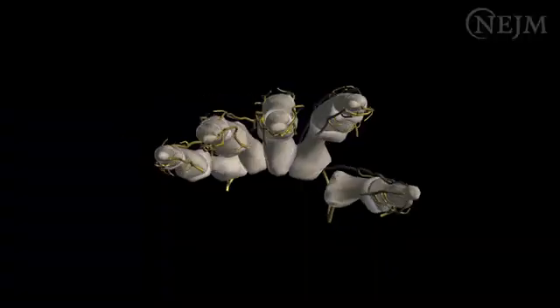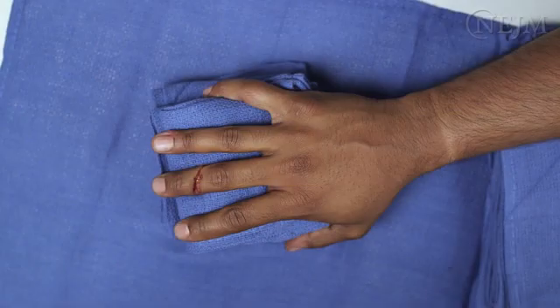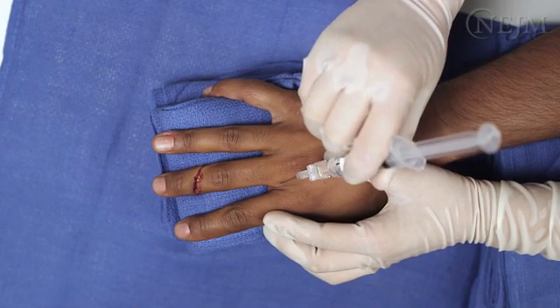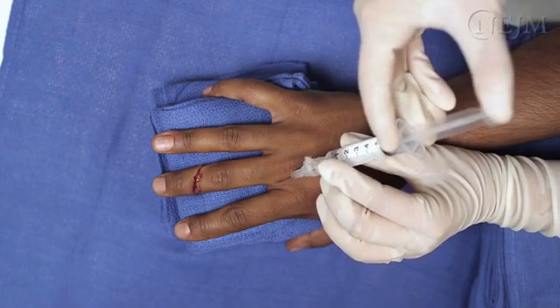Four nerves that run at the 2 o'clock, 4 o'clock, 8 o'clock, and 10 o'clock positions provide innervation to each finger, including the thumb. Identify the web space on the dorsal aspect of the hand, where the finger joins the hand. Insert a 25 or 27 gauge safety needle at the web space and advance it until the needle reaches the palmar aspect of the hand.